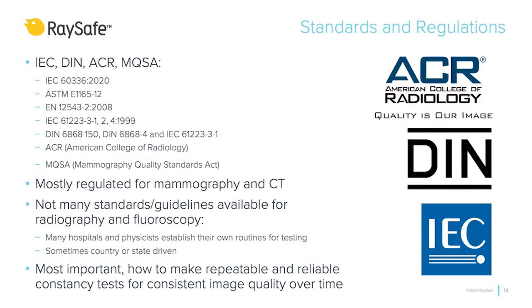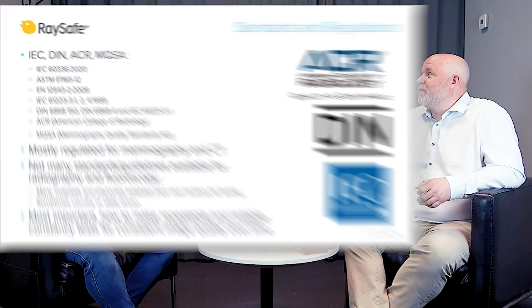In the medical field, phantoms are objects that are scanned or imaged to test, calibrate, or troubleshoot medical imaging devices like X-rays and CT scanners. Some are designed to simulate human tissue, but all are built to provide a consistent, known model that can be used to ensure that the machines are producing accurate and high-quality images.